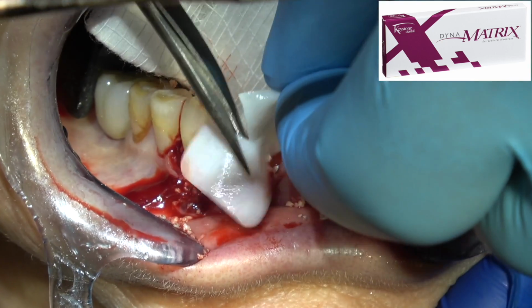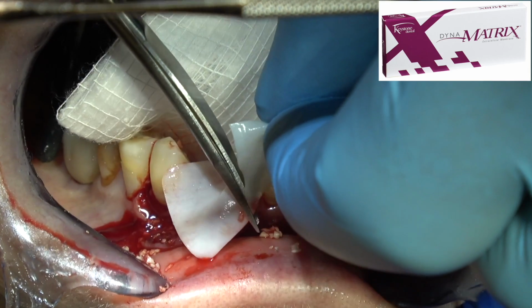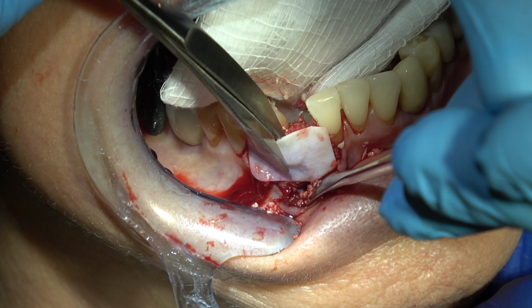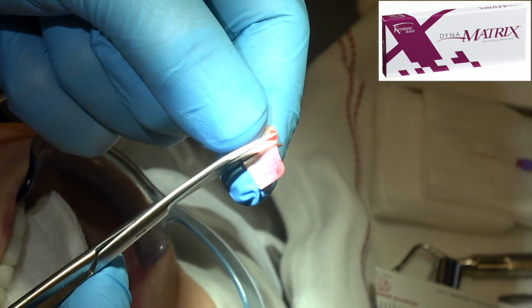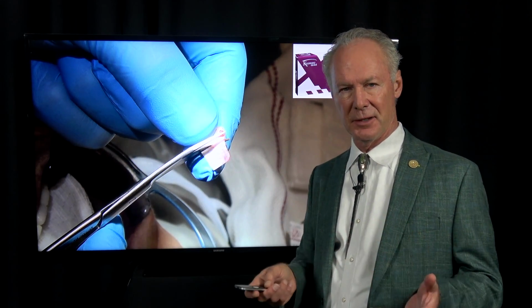So this is a resorbable collagen membrane. We place that over the grafted bone in the socket. Now, why do you use a resorbable collagen membrane? You want bone to grow in the socket and not soft tissue.